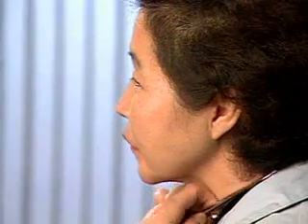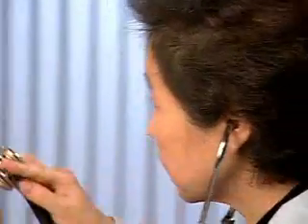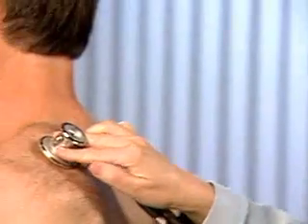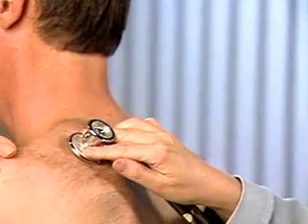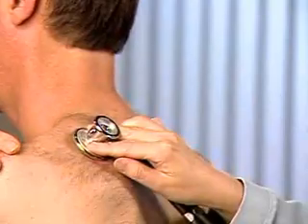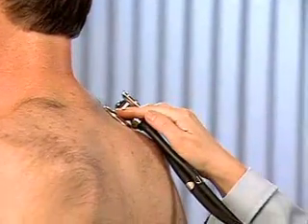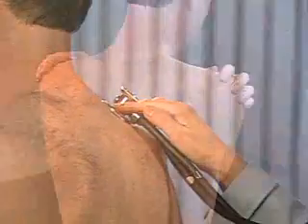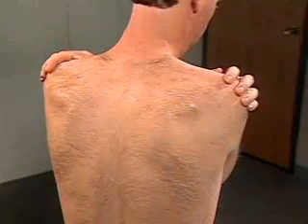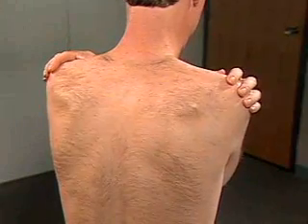During auscultation, have the patient breathe deeply through his mouth. If the patient becomes uncomfortable, allow a rest period. Now let's listen as the examiner auscultates.